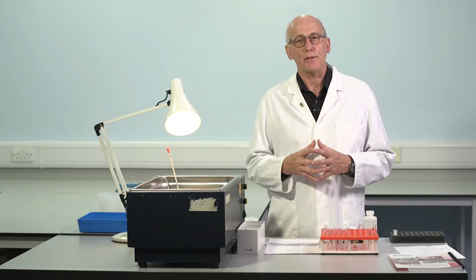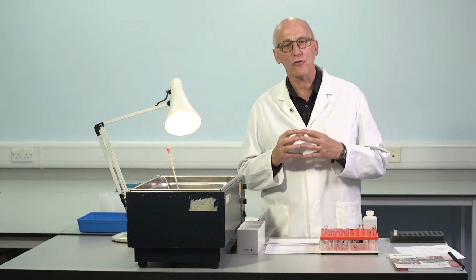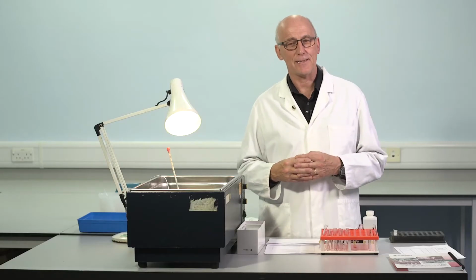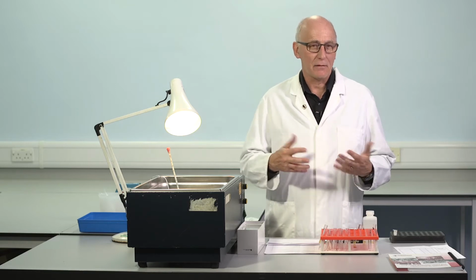So a factor VIII deficient plasma has a very long APTT. We want to add to it a series of different concentrations of factor VIII, and we're asking the question, what's the effect on the APTT of this factor VIII deficient plasma? The more factor VIII we add, the shorter is the APTT. And so we do this by starting with a calibration standard reference plasma.